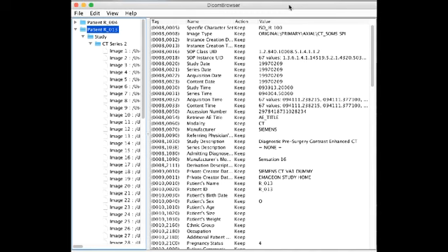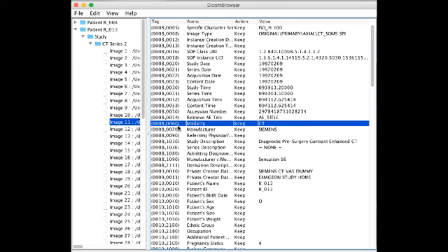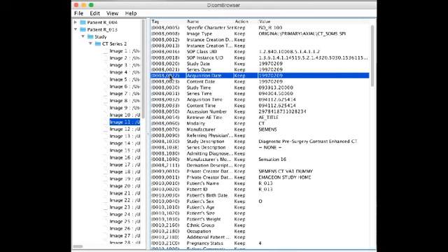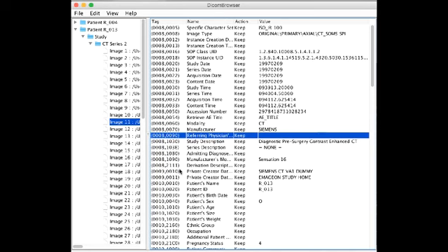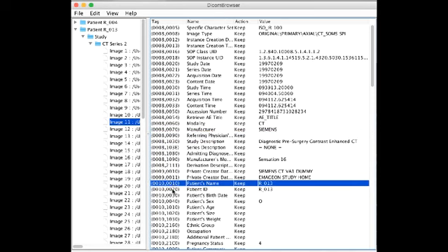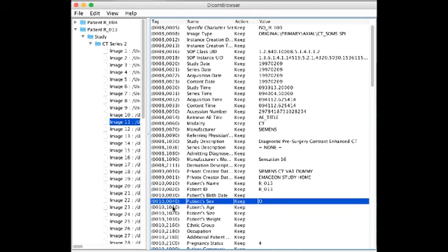So here I've downloaded some images from TCIA into DICOM browser to look at them, and I think we can just have a look and you'll understand DICOM a little better. These are CT studies from a lung cancer patient. And here's the DICOM header. You can see these tags. A tag is a word that describes metadata for that scan. So here you see the modality. It's CT in this case. You can also see when the scan was acquired, what scanner it was on, and a lot of other data here as well. And you can see even more when it's not anonymized, obviously. You'd have the patient's name, ID, birth date, demographic information.